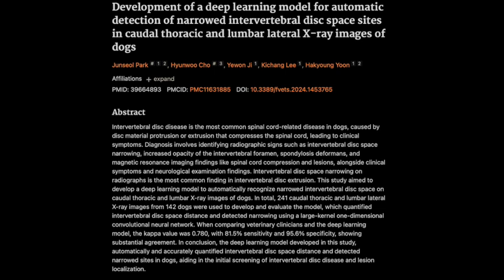They recommend training the model on a larger, more diverse data set, encompassing a wider range of breeds, sizes, and body conformations. Makes sense. And ideally, using higher field MRI for comparison. So what's next? What are the future directions for this research?